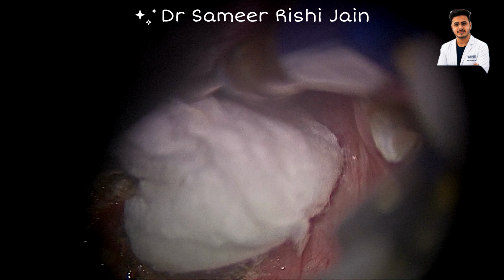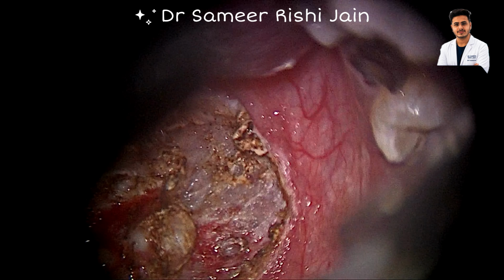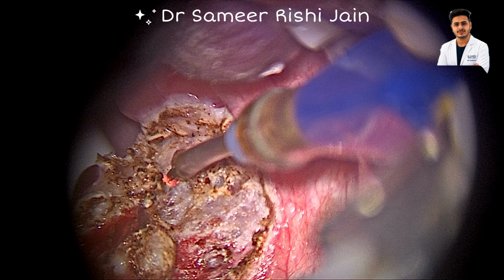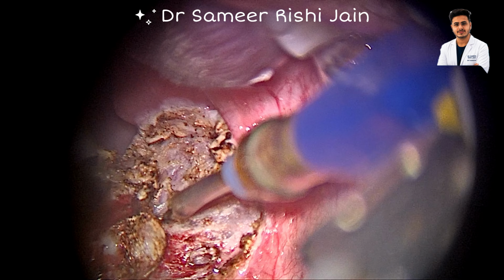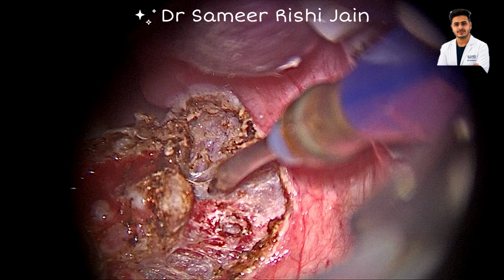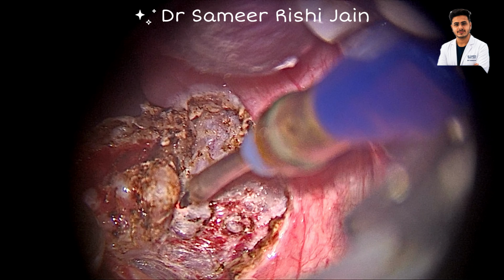A little bit of oozing, which is venous oozing, can be stopped using the monopolar cautery itself, and a large arterial bleed can be stopped with the help of a bipolar cautery. I will give a good traction and I will use the cautery at the junction of the connective tissue and the tonsil. As you can see, the tonsillar tissue is coming out like a book.